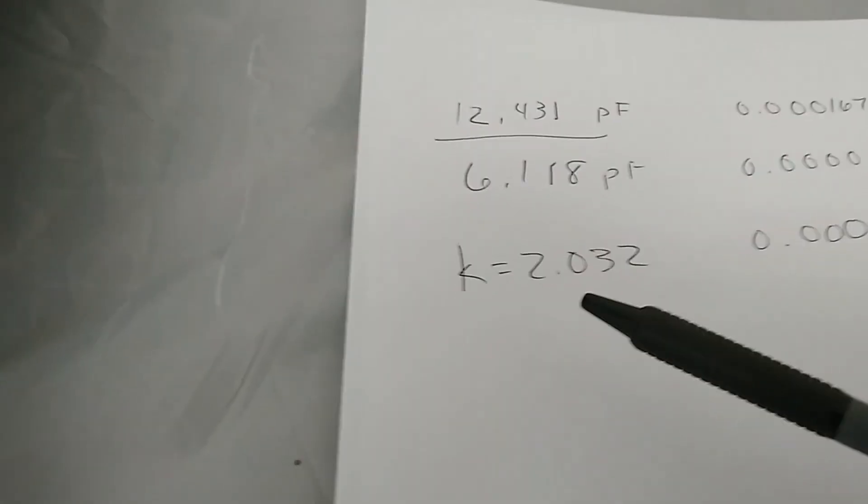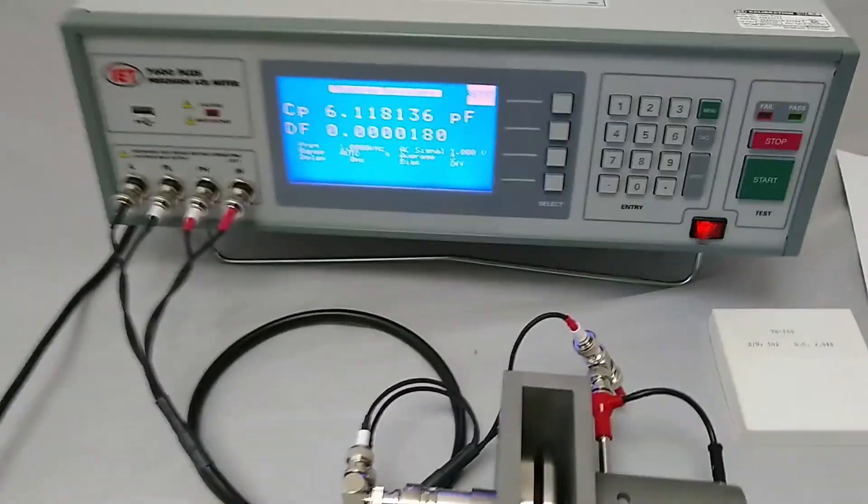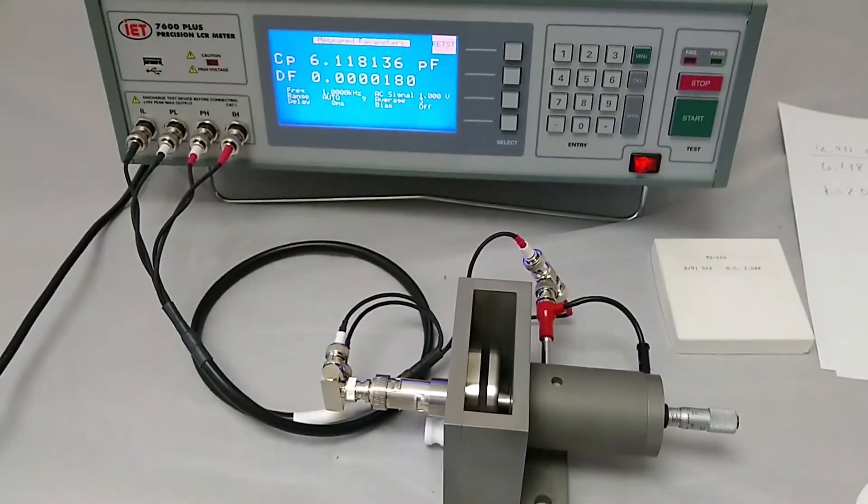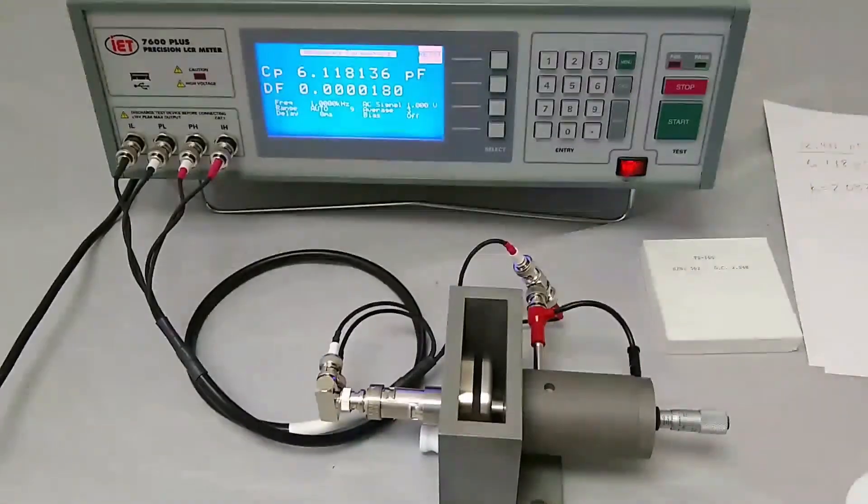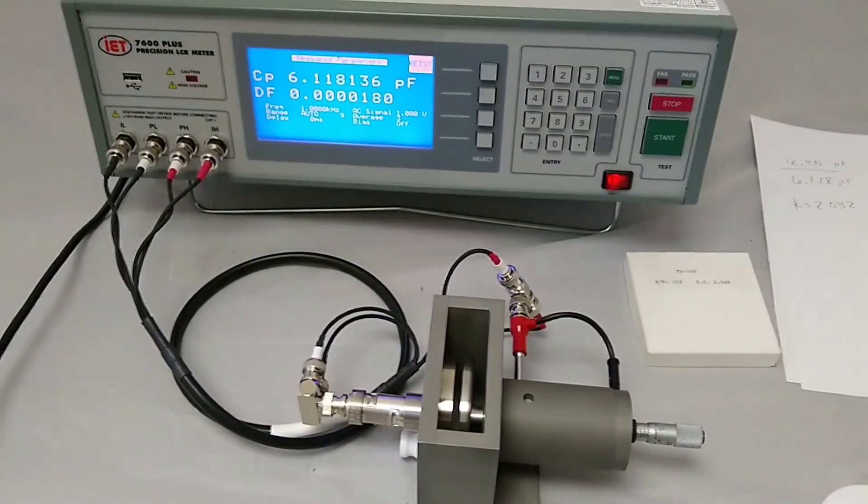Dielectric constant 2.032 compares quite well with the calibrated value of 2.048. This is really all there is to basic dielectric constant measurements with the 7600 Plus and the LD3 cell. Thank you.